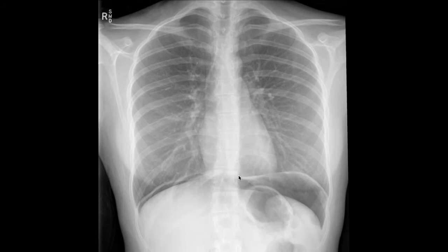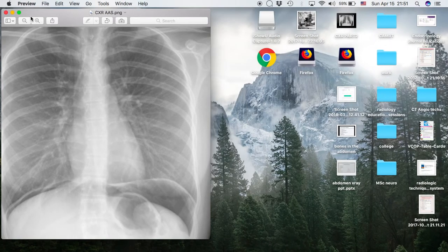This is the muscle of the diaphragm. The muscle here becomes so clear because of the distinct density change between the air and the diaphragmatic muscle. So you have here air that has escaped from the abdomen and went all the way up to reside under the diaphragm right here. And I guess this case is a perforated stomach ulcer that caused air to escape under the diaphragm.